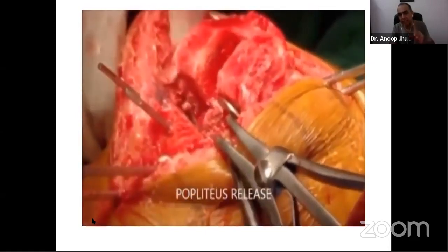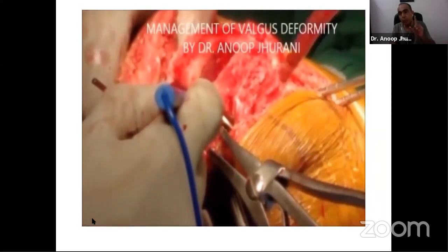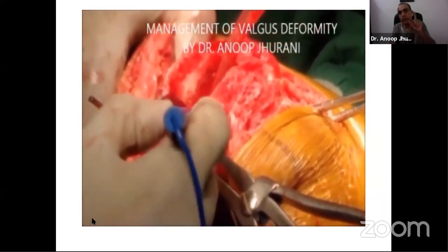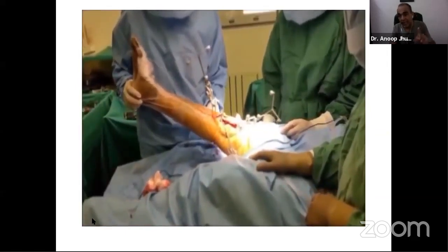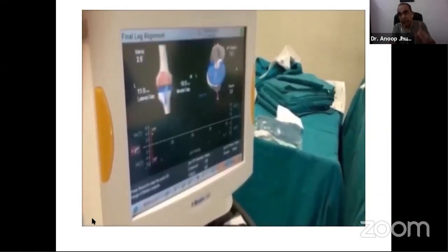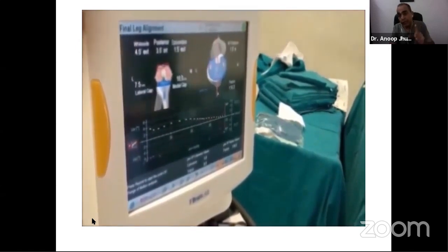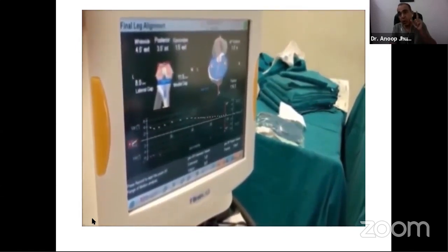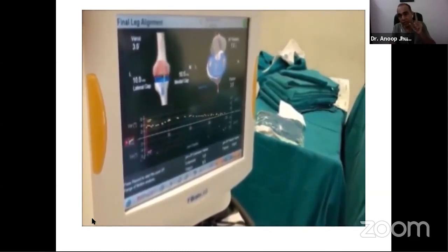It's still tight in flexion, and you can see that the knee is tight in flexion. And this is when we can release the popliteus. We can do pie crusting and we can do a partial release just to open enough for our poly to walk in easily. And this is an indication: if your knee is in valgus in flexion, then you need a popliteus release to balance the knee. One of the reasons of big more medial opening is poor balancing of lateral compartment in flexion. When you balance that, when you release the popliteus under control, your knee falls very nicely into a rectangular gap.